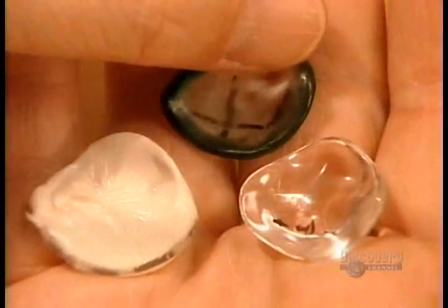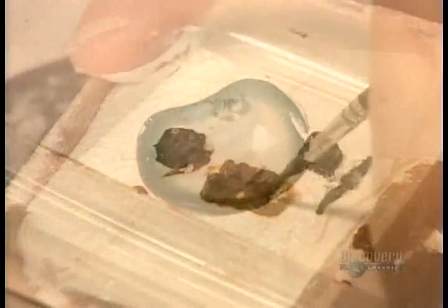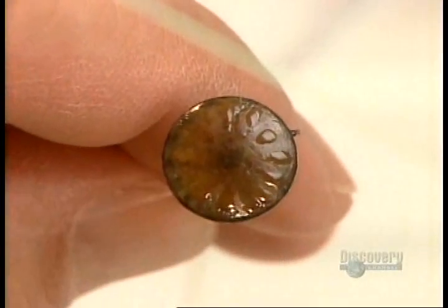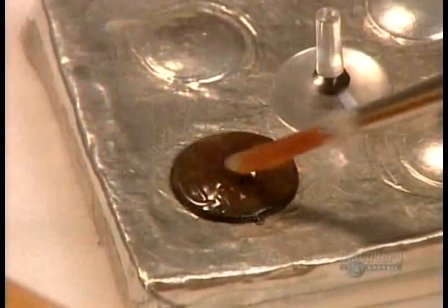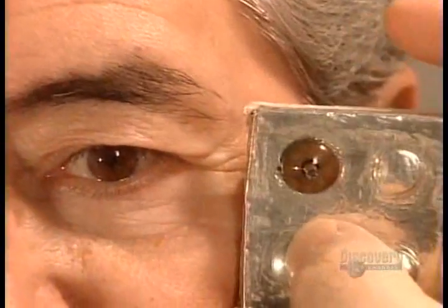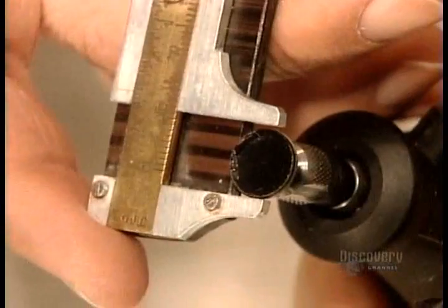Now they take this marked and enlarged fitting shape and make a plaster mould. They'll later use that mould to cast the actual artificial eye. But first, they have to make the iris. They take a curved black acrylic disc and paint it as realistically as possible with high-quality artist's oils. The patient has to be present so they can match the real eye. Next, they glue an acrylic cornea with an appropriate size pupil onto the painted iris. At this point, the artificial iris is 13mm in diameter. If the patient's real iris is smaller, they trim down the replica to match.